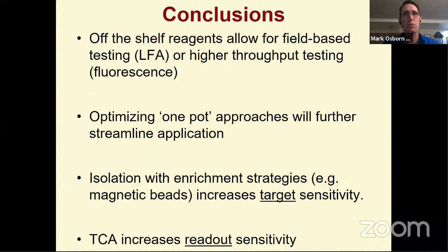So overall, my laboratory's goal was to pivot our research using CRISPR-Cas9 to determine whether we could use it in the SARS-CoV-2 diagnostic space with a biotinylated Cas9. We're able to do that on lateral flow assay technology to fulfill the requirements of a FITC biotin conjugate to detect at a lateral flow assay. That sensitivity is improved by thermal contrast amplification.